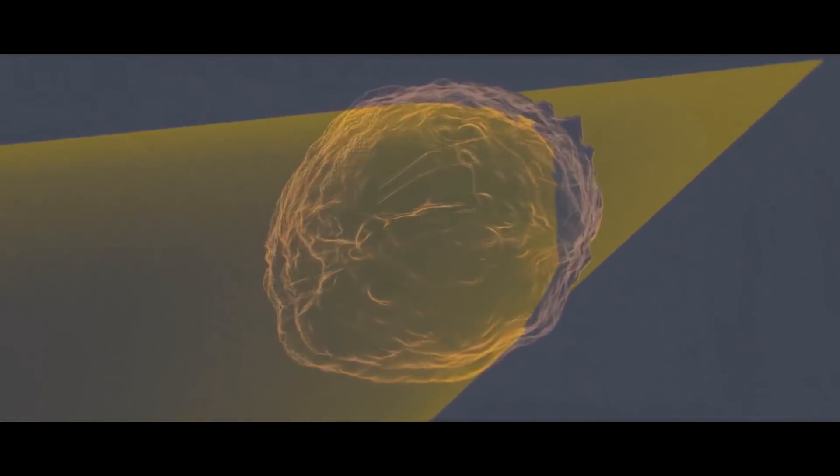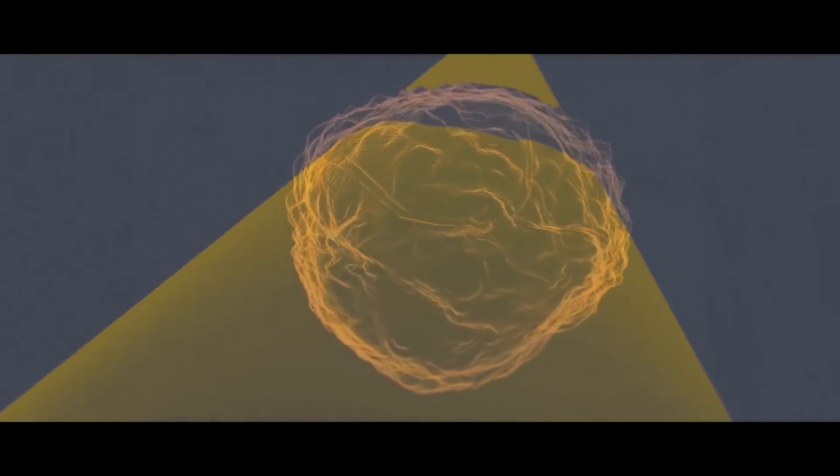It can do that on the fly as the beam is moving in an arc of radiation around the tumor. And if we actually control these leaves dynamically, we can vary the intensity of the radiation that's emitted from the linear accelerator.